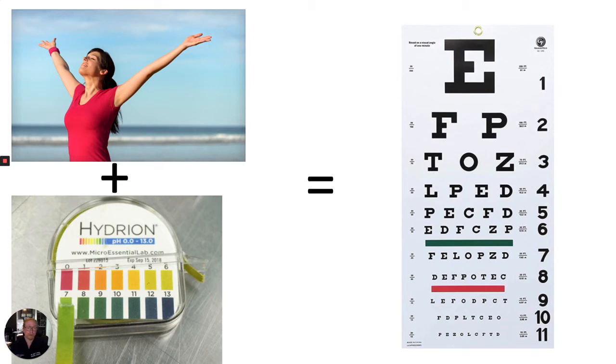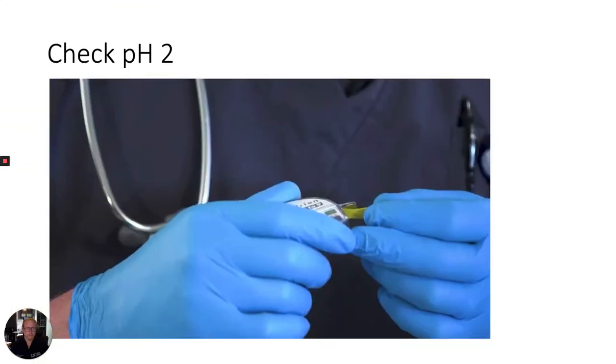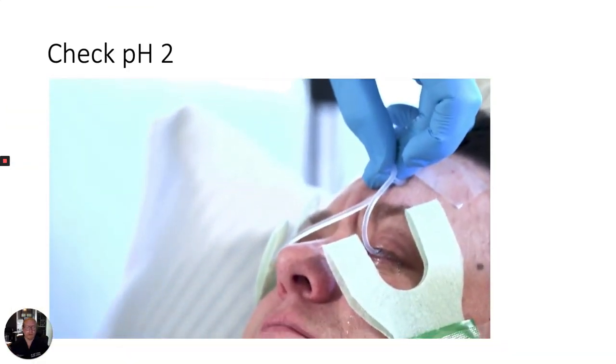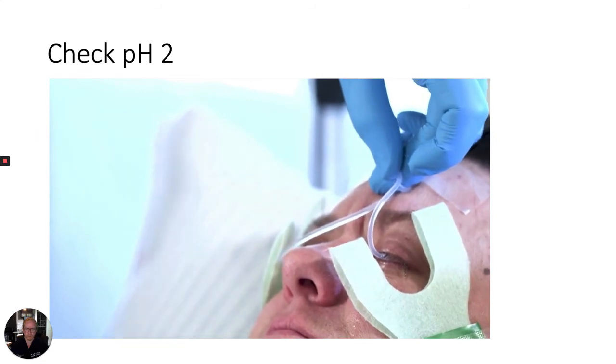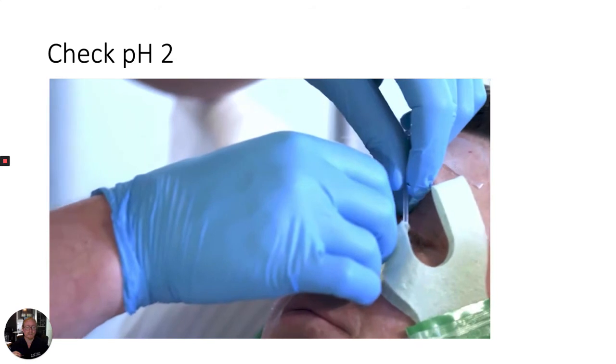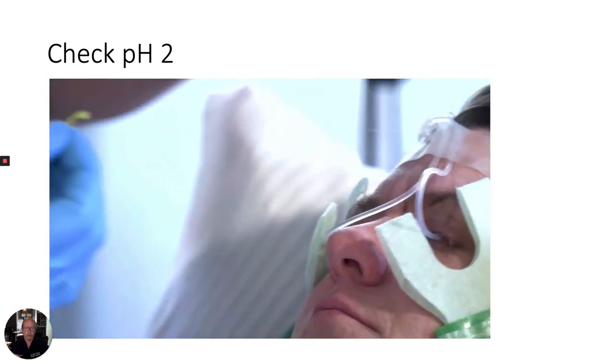Fortunately, the Morgan lens doesn't need to be removed to recheck the patient's pH. To check the patient's pH during irrigation, first stop the IV flow to the Morgan lens for one minute. Then occlude additional flow by pinching the distal tubing of the Morgan lens. Retract the lower eyelid and gently touch the pH paper to the conjunctival fornix.